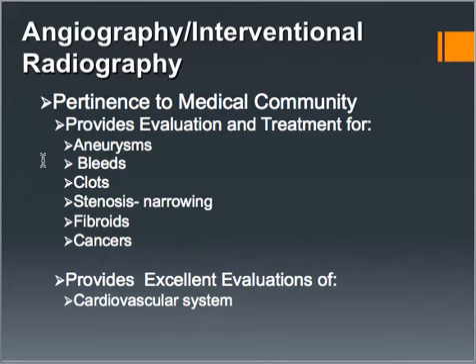It's used to treat bleeds, so they can do catheter embolizations that block the blood flow. They can either inflate a balloon or put a gel or foam in there to actually stop the bleeding. And those are done a lot in emergent situations. Sometimes if a woman has a baby and she's hemorrhaging and they don't know why, they can quickly get her into interventional radiology, figure out where she's bleeding from, and stop the bleeding. Same with trauma situations. Depending on where the hospital is located, if it's a trauma center, then there might be an interventional radiology suite where they are on call or staffed throughout the night for trauma situations like that.